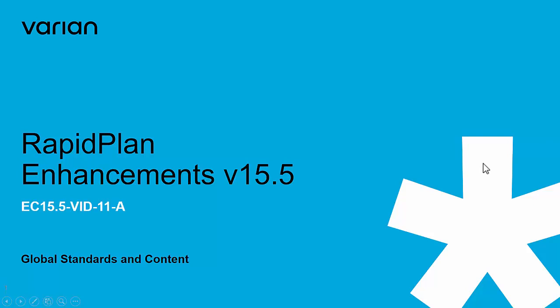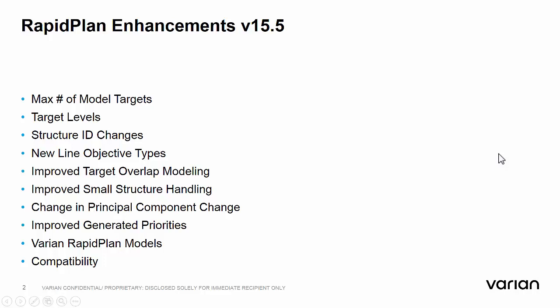Welcome to the information session on enhancements in RapidPlan version 15.5. I'm excited to share the enhancements that have been made to RapidPlan in version 15.5. The objective is that in the next few minutes, you will learn all about the changes and make use of this information to transition smoothly to version 15.5.